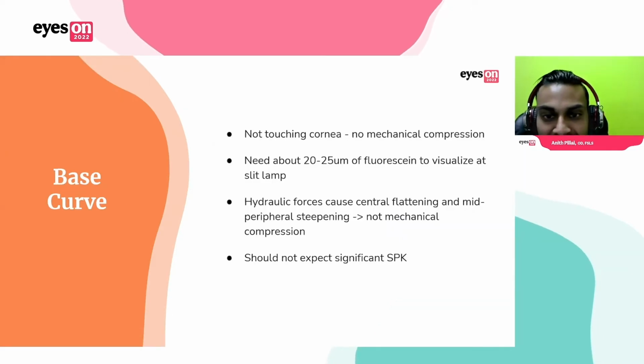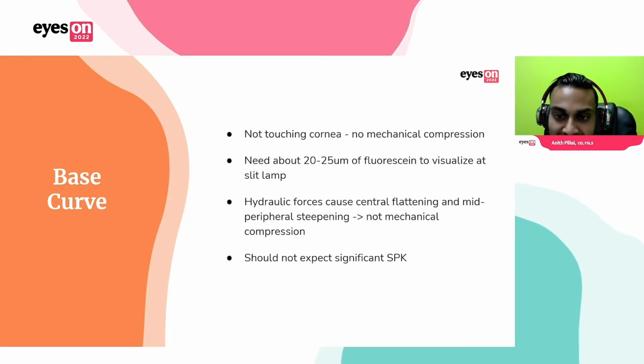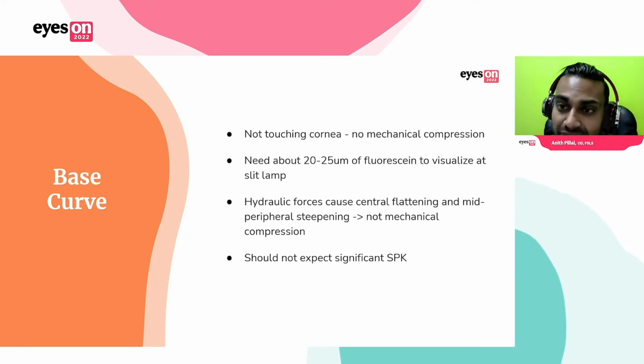So again, we're using those hydraulic forces to cause that flattening. It's not a mechanical compression. In fact, if we had mechanical compression, you would see significant SPK, and that's not a desired result when we're doing a properly fit Ortho-K retainer.